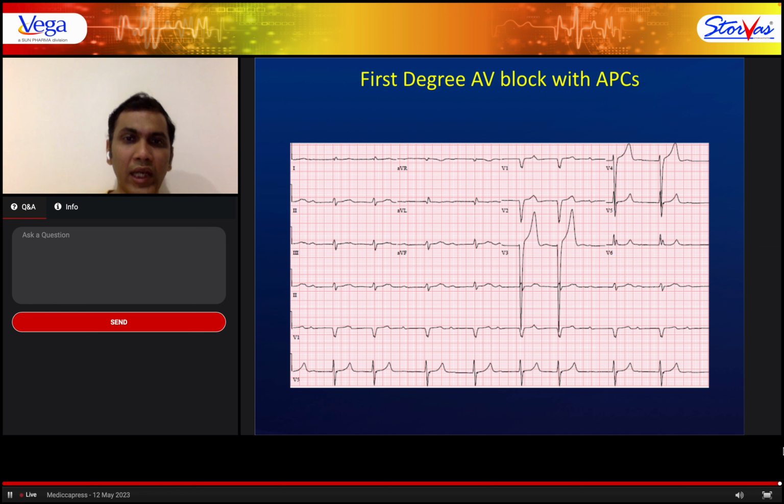This P wave may not be very well seen. Now, taking a look at this and saying, oh, the patient has a junctional rhythm may not be right. You look at the P wave here, look at the conduction to the ventricle, it is prolonged. This P wave conduction to the ventricle is prolonged. In AVF, again, the P wave is positive, perhaps not very well seen. But even if one does not see a positive P wave, the axis remains consistent. Let's take a look at V2, the P wave is positive. So there is a sinus node exit to the P wave. The coupled beating that you can see here is probably because of small APCs where the P wave in that particular lead is not very prominent.